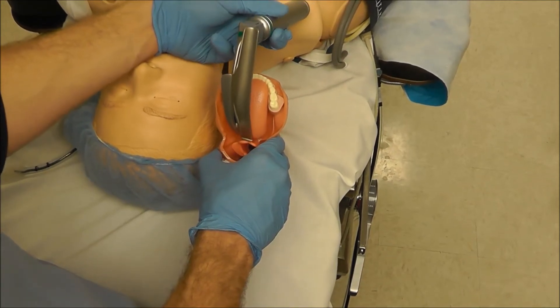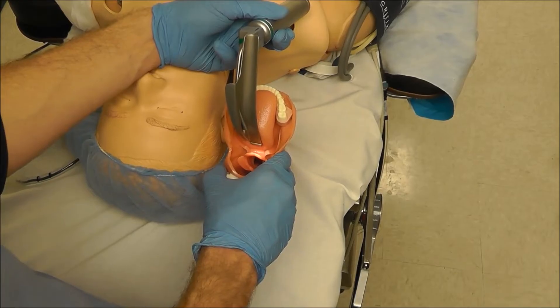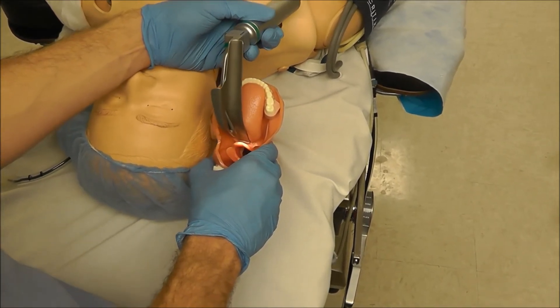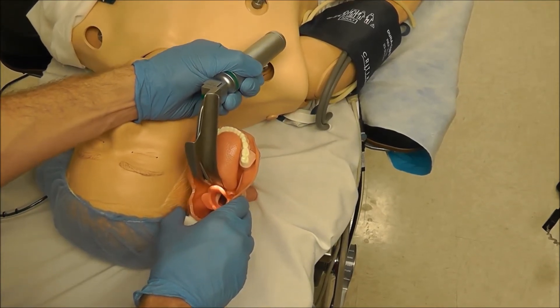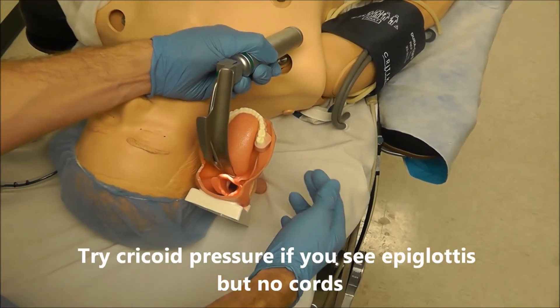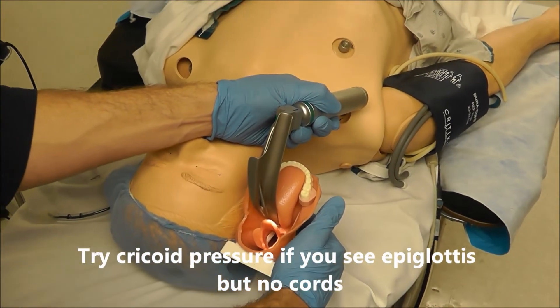If you do lift and see some epiglottis but no vocal cords, sometimes you can try going into the vallecula a little bit more and then lifting. But if you're pretty well seated into the vallecula and are lifting and still can't see vocal cords, you can ask someone to give you cricoid pressure — and a lot of times that can help the vocal cords come into view.